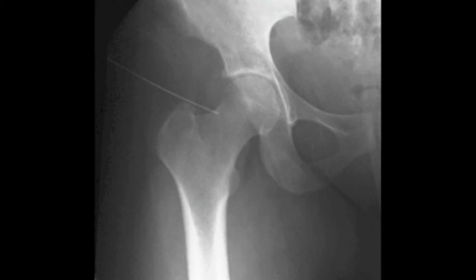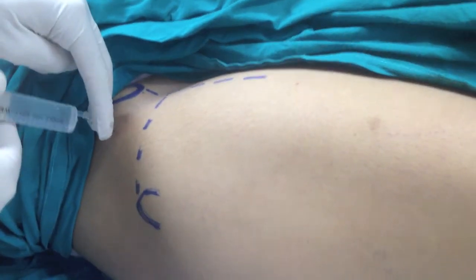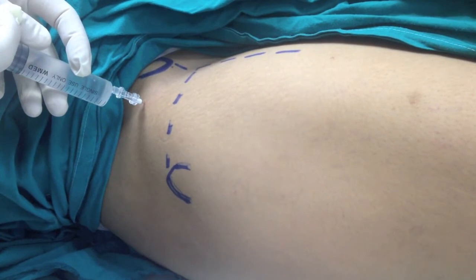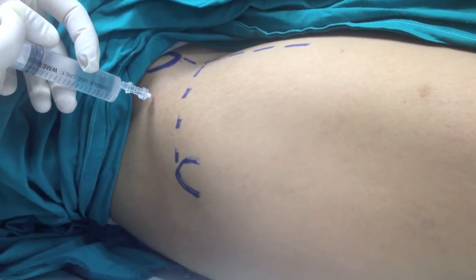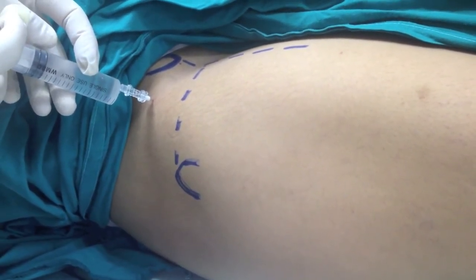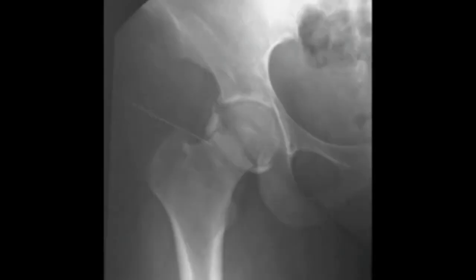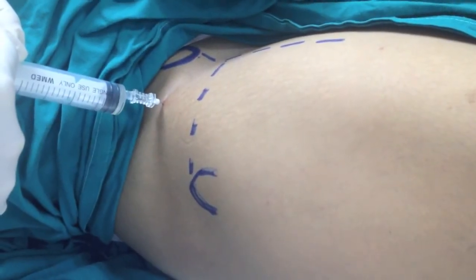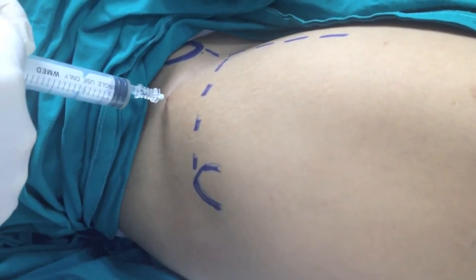In this video, a C-arm and dye are used to confirm the accuracy of this technique. After injecting 2 milliliters, a check image is taken which confirms intra-articular placement, with the shape of the dye being limited by the zona orbicularis. The rest of the fluid is then injected into the joint and the needle is withdrawn.